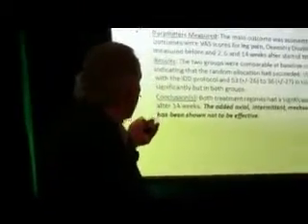It took 60 patients, divided in half, 30 patients sham with a graded activity program, and 30 patients with the active spinal decompression. They used 4.5 kilograms, 10 pounds for the sham group. They followed protocols of the manufacturer, 50% of the body weight gradually achieved, plus 10 pounds. The added axial intermittent mechanical traction to a standard graded activity program has been shown not to be effective.